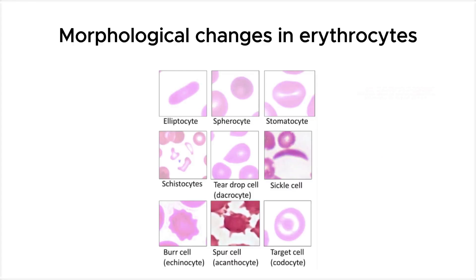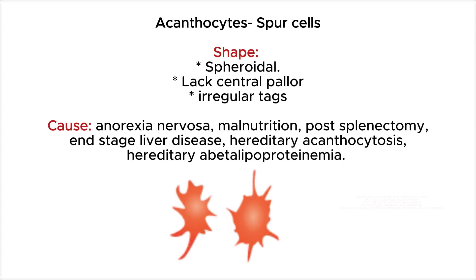Life under microscope: morphological changes in erythrocytes. In this video we will talk about the morphological changes in erythrocytes such as acanthocytes, echinocytes, elliptocytes, spherocytes, stomatocytes, schistocytes, teardrop cells, and sickle cells. Acanthocytes are spheroidal and lack central pallor.